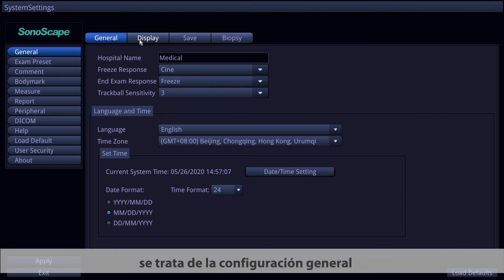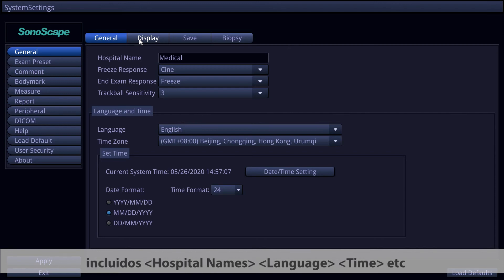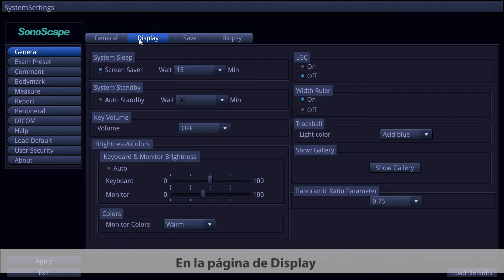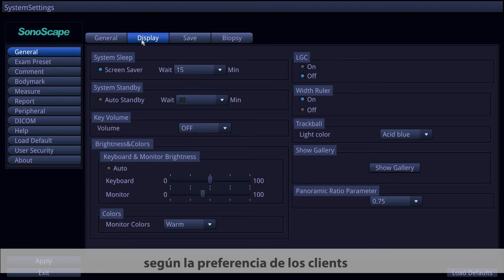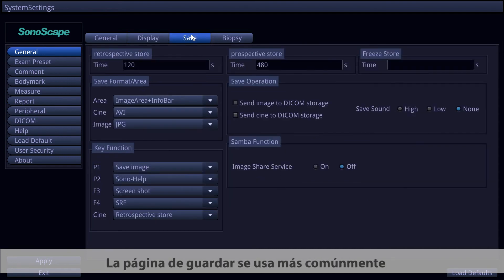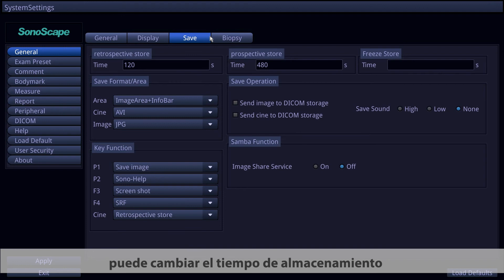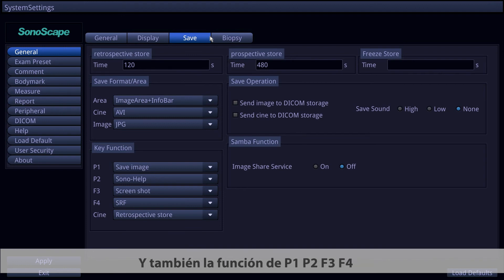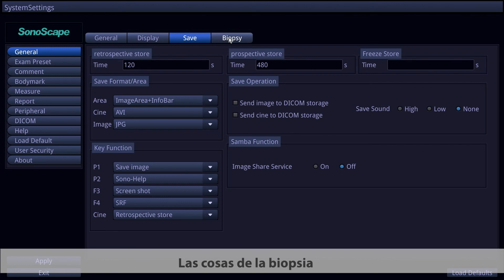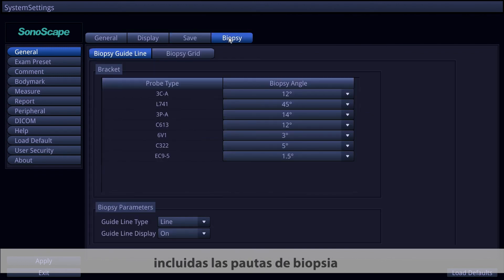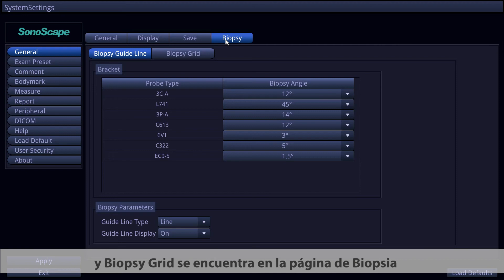On the General page, settings include hospital name, language, time, and more. On the Display page, you can change display preferences. The Save page is commonly used — here you can change storage settings and configure key functions for P1, P2, F3, F4, and Cine. The Biopsy page covers biopsy guide line and biopsy grid settings.